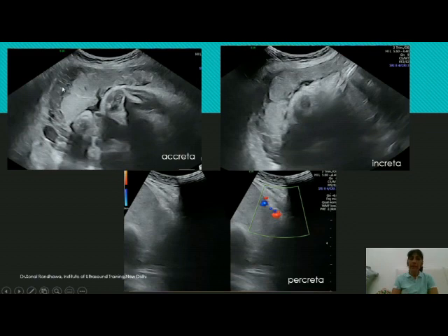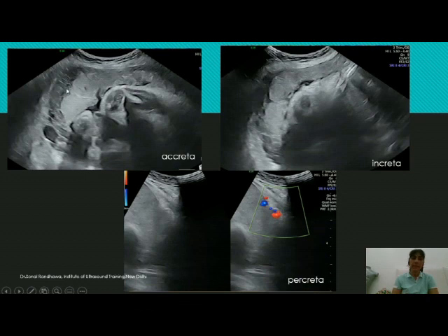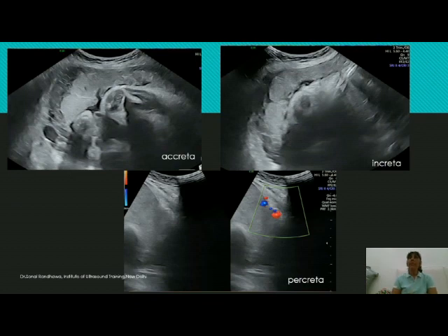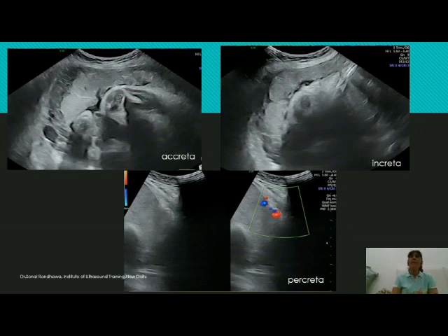If these white lines were parallel to the placenta we would say they are just the walls of the retroplacental vessels, but look carefully — they are running perpendicular to the placenta. Many of them running perpendicular through the myometrial area: these are adhesions. This is telling you this is placenta creta. Because the space is maintained — or sometimes slightly reduced — but what you are seeing are adhesions, so we call this placenta accreta.